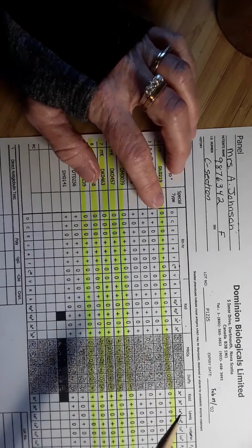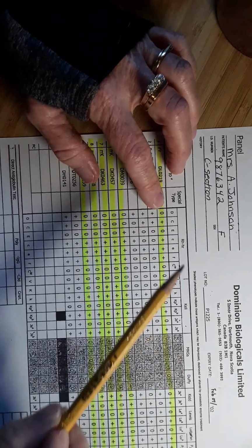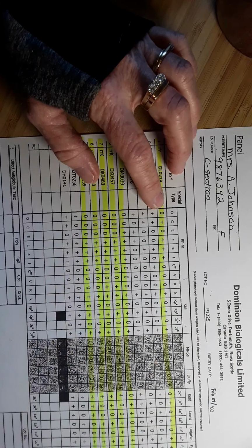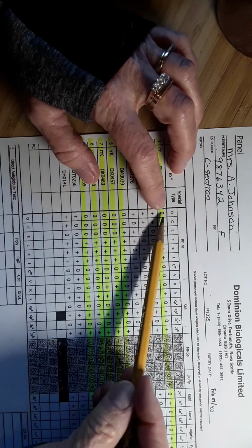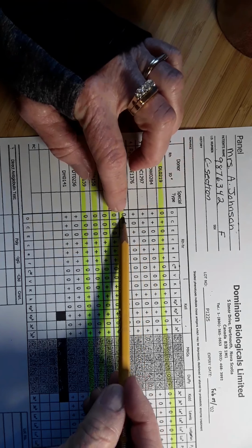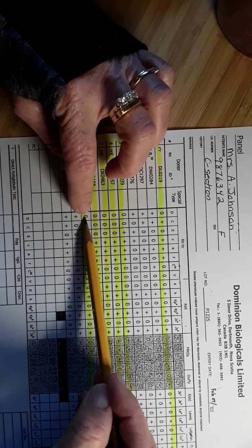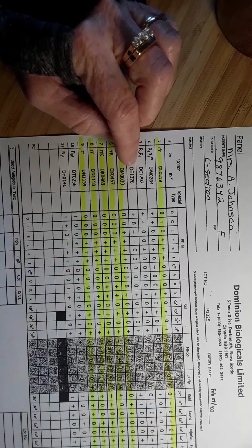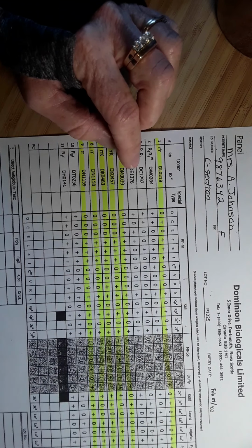I'm looking for D positive cells that did not react with my patient's plasma. And I have the rows highlighted that did not react. So when I look down here, I'm just looking at these highlighted rows. Okay, I don't have any D positive cells that did not react with my patient's plasma.